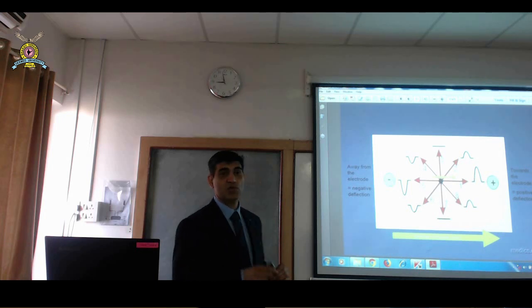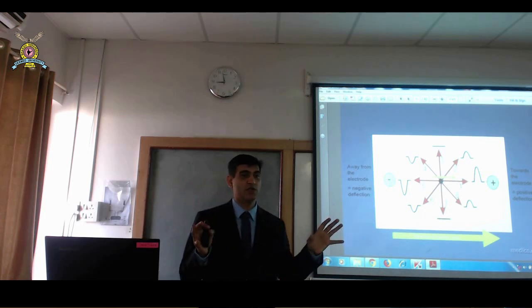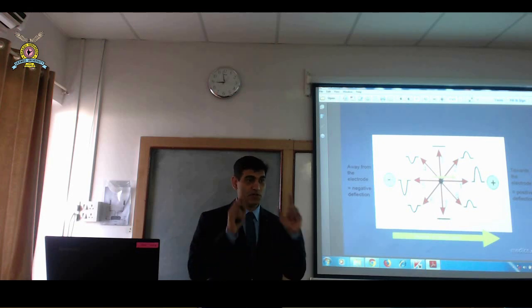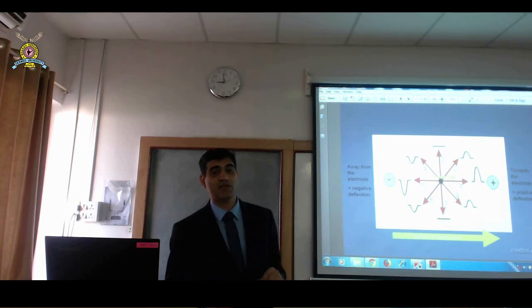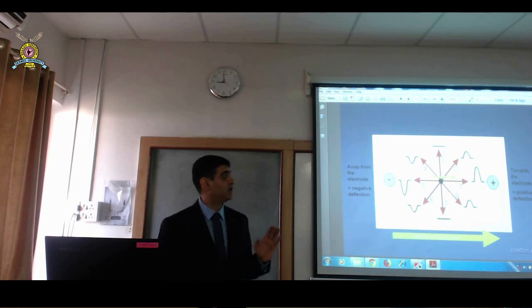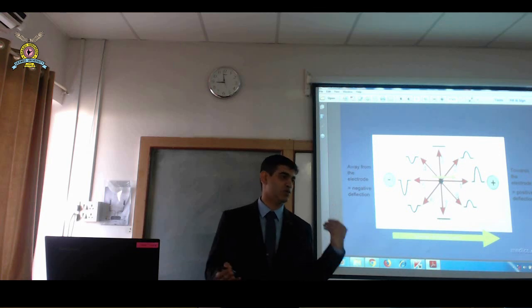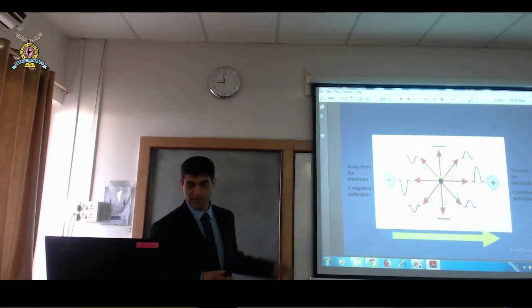The same impulse you will see from a different angle. If you look at the heart and all the electrodes, basically imagine electrodes are cameras. Electrodes are nothing but cameras, and you are looking at the heart from different angles. These are not video cameras; they are electrical cameras. They don't take a video image; they take an electrical image, and that's how simple it is. If the electricity goes towards you, you're going to get a positive wave. If the electricity goes away from you, you're going to get a negative wave. Very simple. That's what this diagram means.